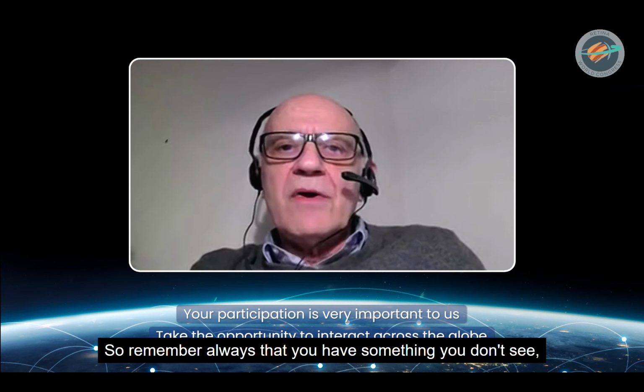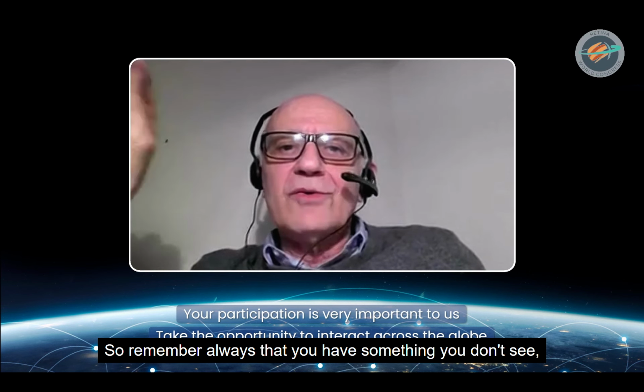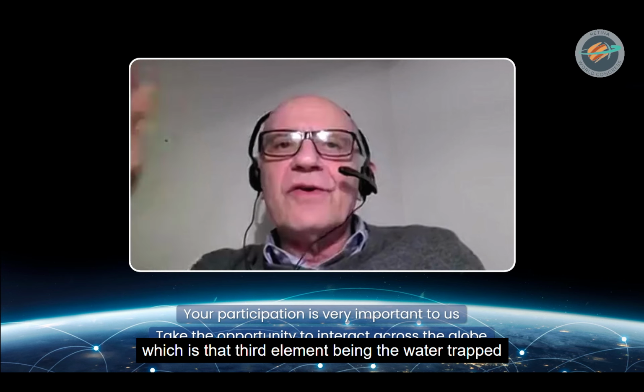So remember always that you have something you don't see, which is that third element, the water trapped between the silicone oil bubble, which is going in, and the perfluorocarbon bubble, which is present on the retina. That must be removed. Otherwise, you will have problems. Good point, Jean-Paul. George?